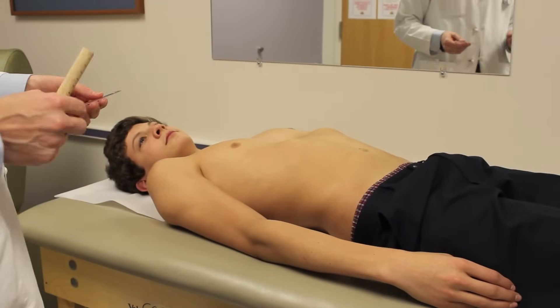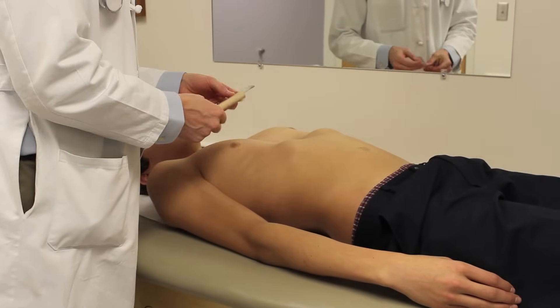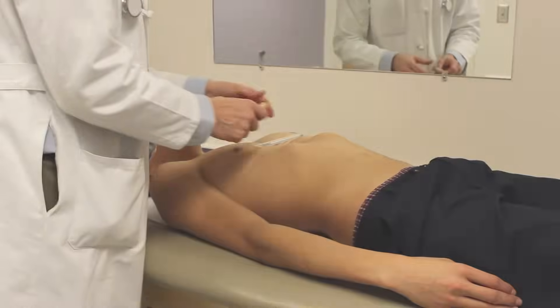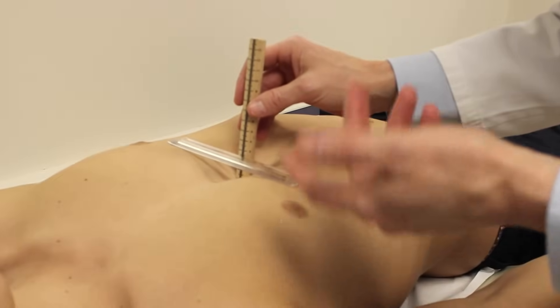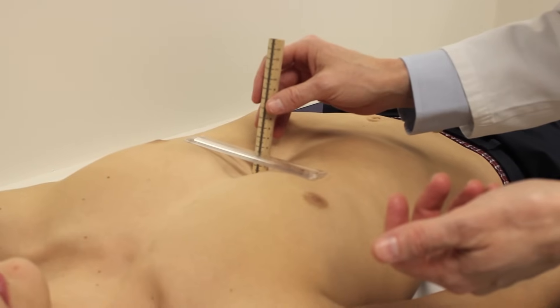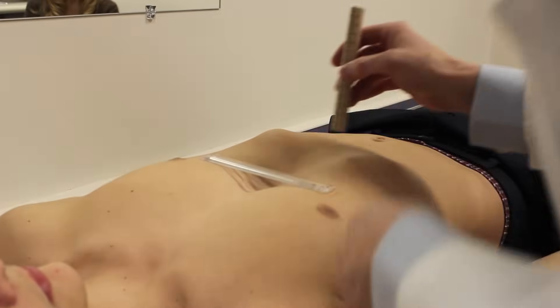This isn't highly scientific — these are estimates of course. We'll get a measurement by putting a straight edge across the chest, kind of at the deepest point. There's a little bit of variation there, so we're at about 2.5 or so.